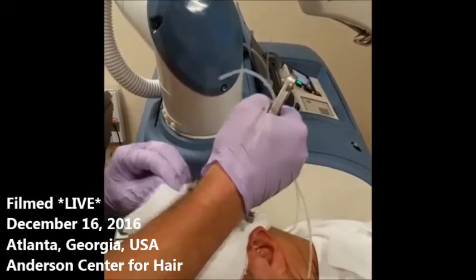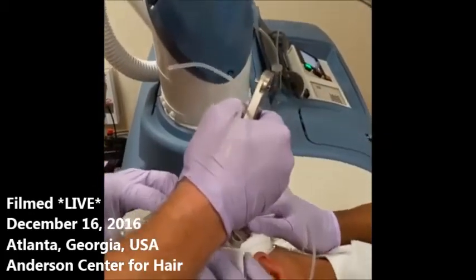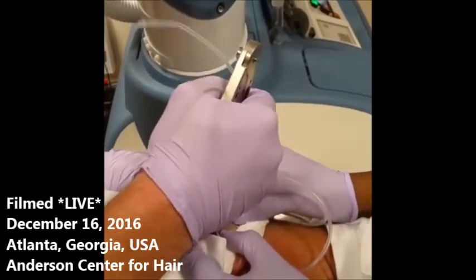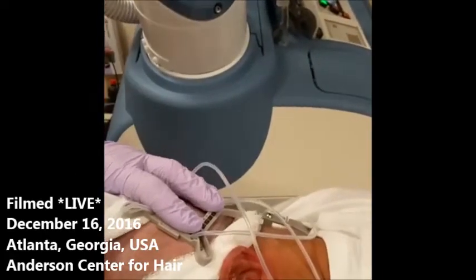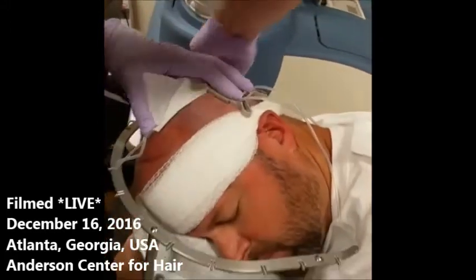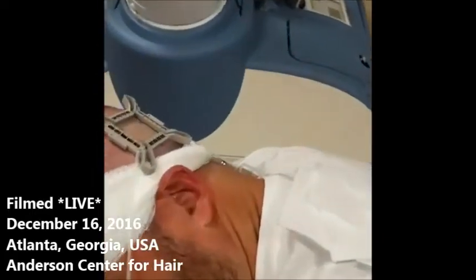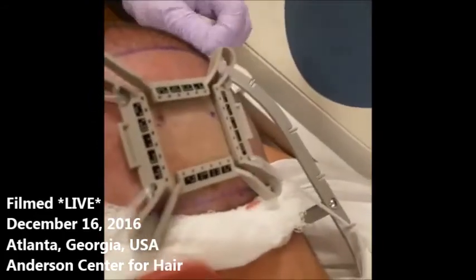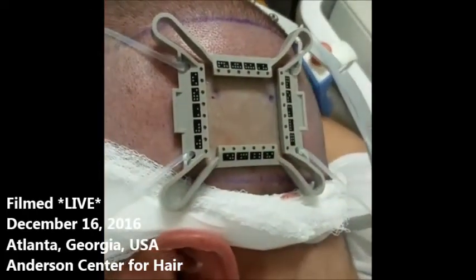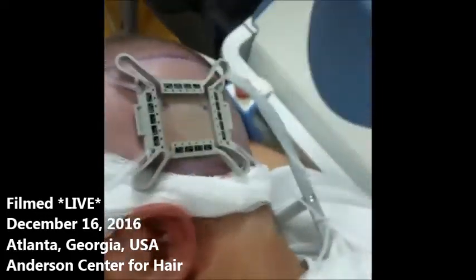We're going to put the first grid right there. We're going to bring it north a bit and strap it in nicely, and then check to make sure it's nice and flat and achieves a planar surface for optimal graft extraction. You can see the color of the skin inside the tensioner is much lighter than the pink skin on the outside because of the tension placed by the tensioner.